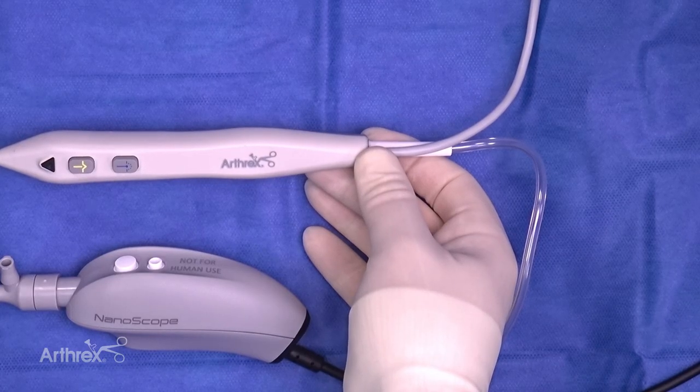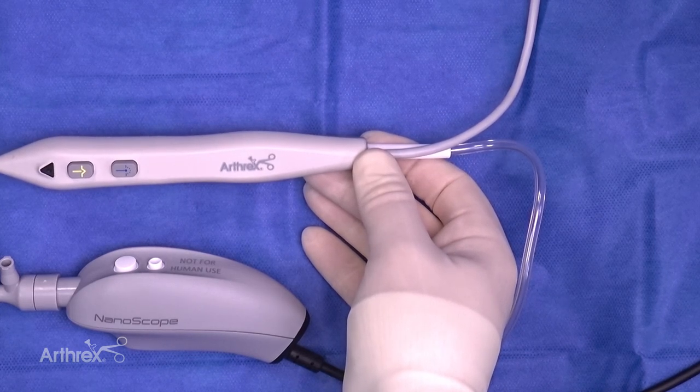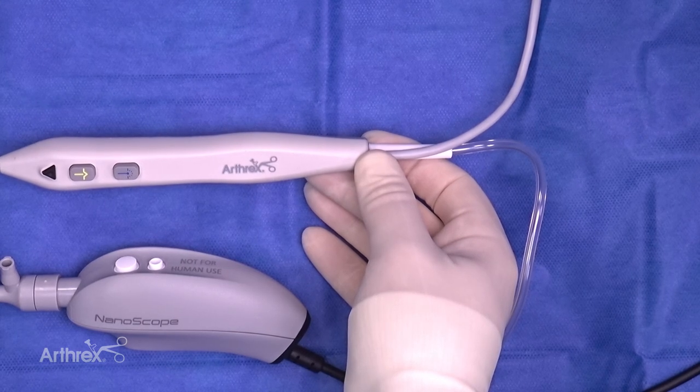For our small joint and Nano applications, it's got optimized aspiration capabilities, and it also has a decreased power setting, so you don't have to worry so much about increased temperature inside the joint.